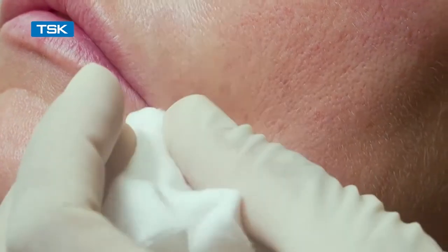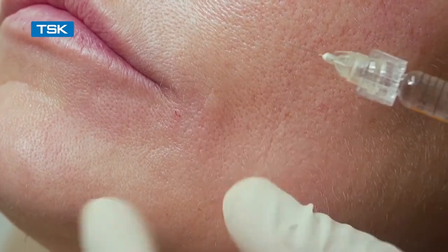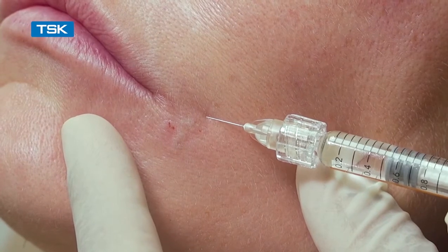There the line is being effaced. The majority of the inferior part of the line is effaced and that can be completed superiorly.